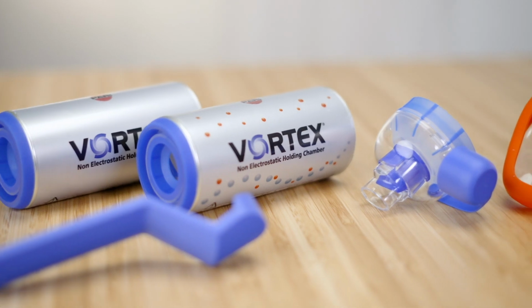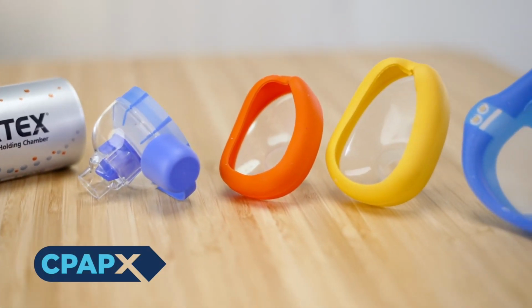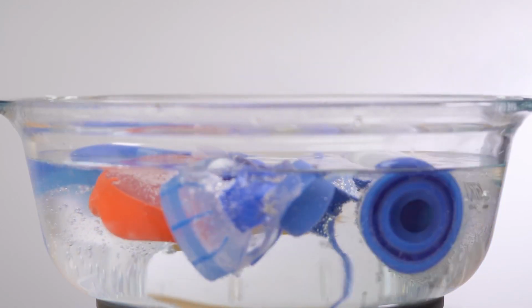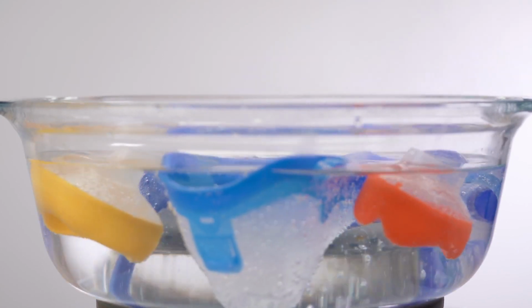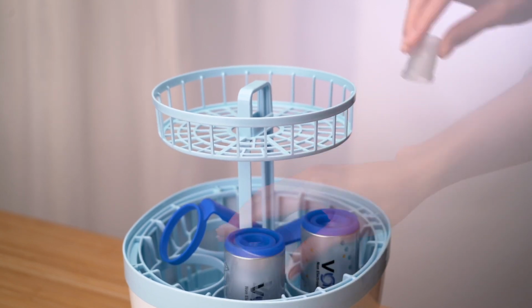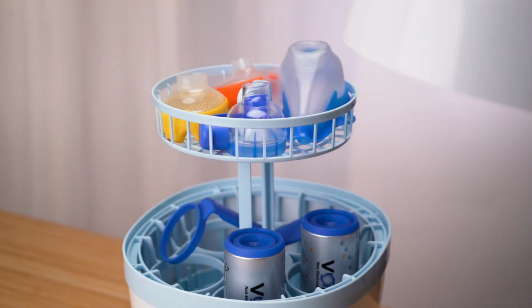Disinfect the vortex after cleaning. There are 2 options available for disinfection. To disinfect with boiling water, you will need a clean pot and tap water. The plastic parts must not touch the base or sides of the pot, as the plastic may otherwise melt. Alternatively, they may be disinfected with a standard thermal disinfector for baby bottles.